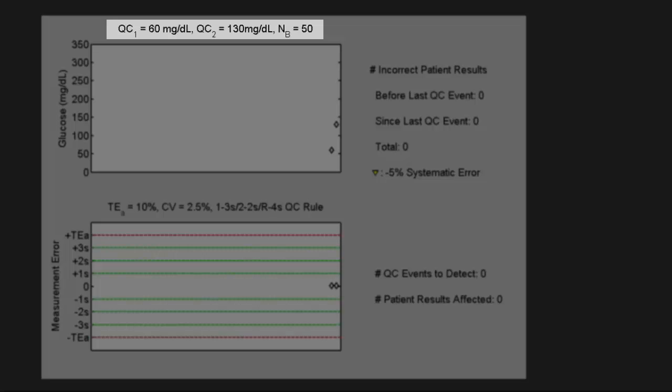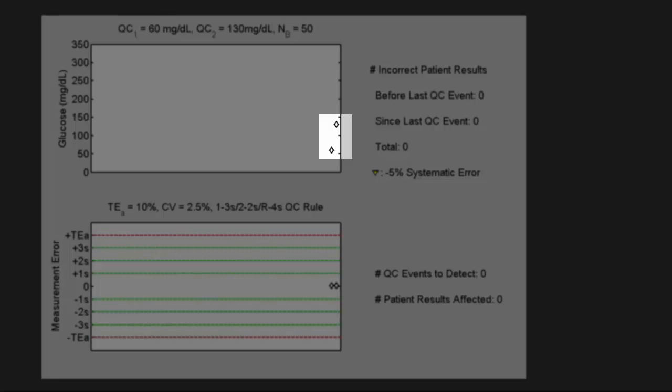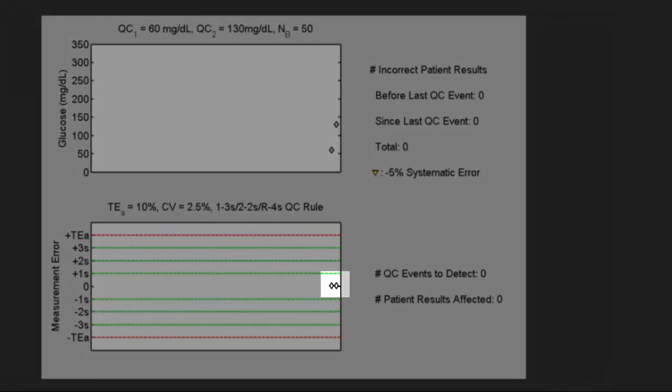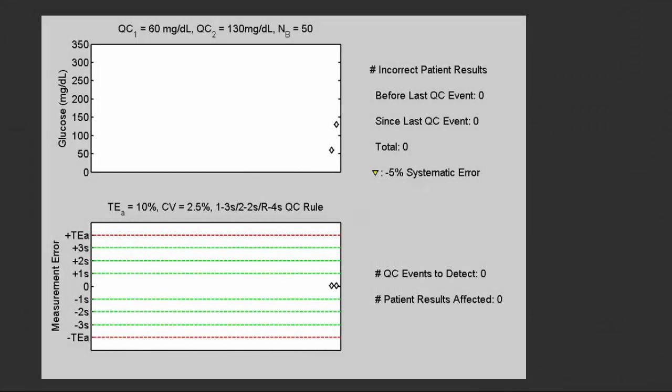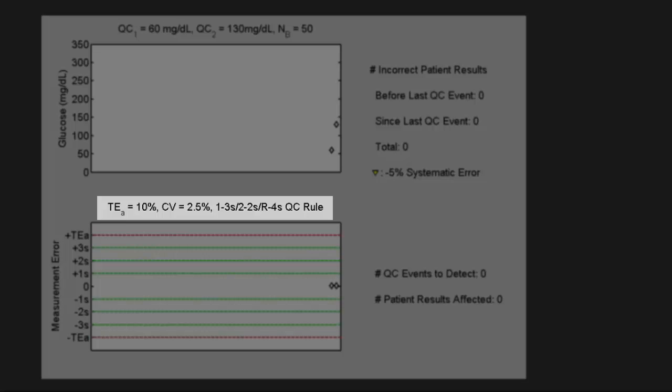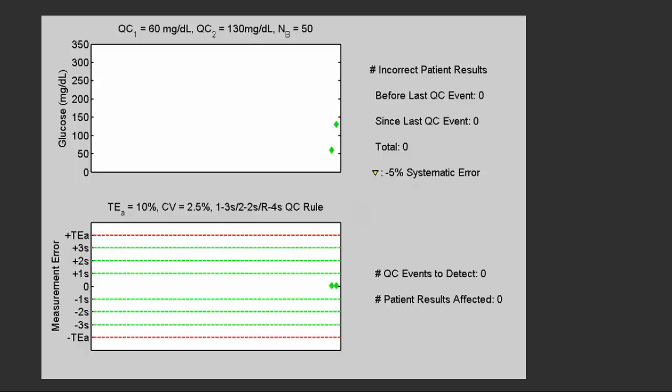The diamonds represent the QC results. We begin the process with a QC event. The measurements are around 60 and 130. Here we see the measurement error for those results - in this case the measurement errors are both close to zero. We're going to assume a TA of plus or minus 10 percent, a CV of 2.5 percent, and that the lab is using a 1-3s, 2-2s, and R-4s QC rule combination. These two QC results are within one SD of their assigned values, therefore the QC rule is accepted.